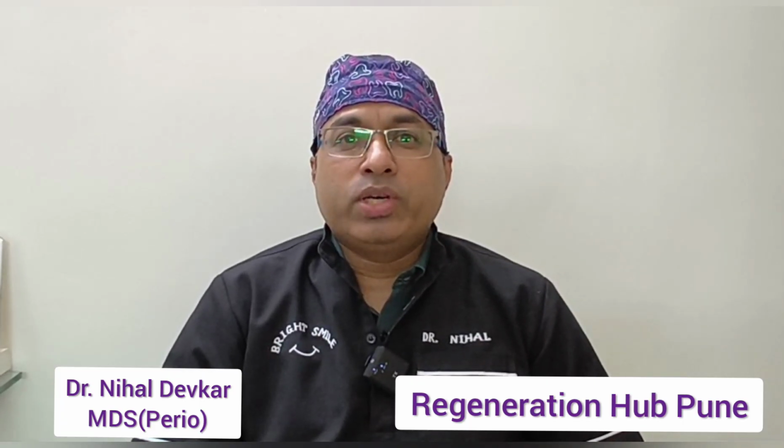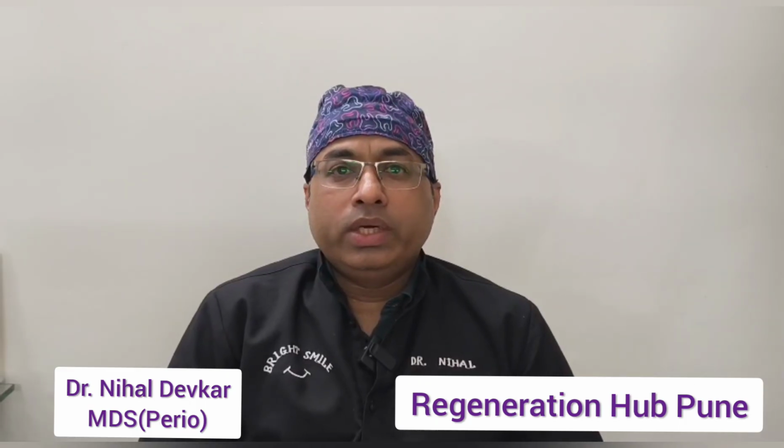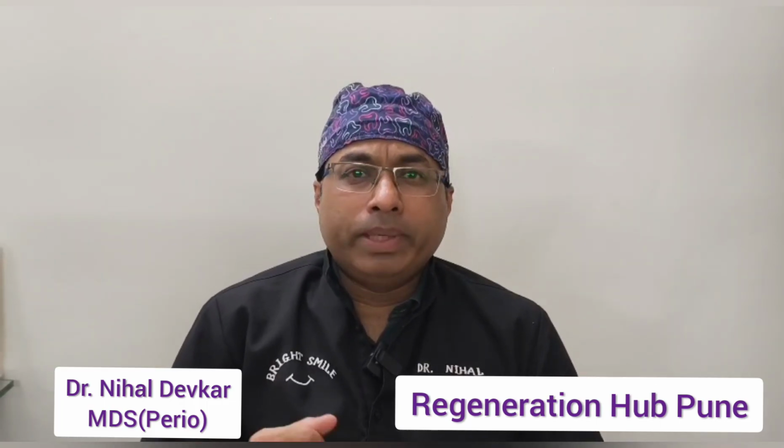Hello everyone. Today the procedure that we are going to demonstrate is the crown lengthening procedure, also famously known as CLP. Now, in what cases do you need to perform this procedure? There are various instances wherein the crown structure is damaged for either a single tooth or multiple teeth.